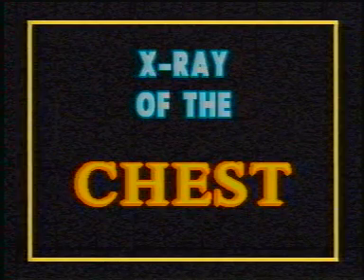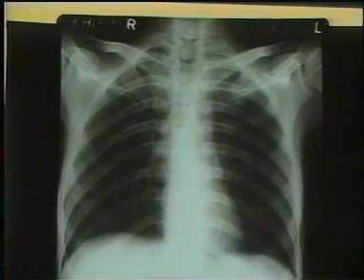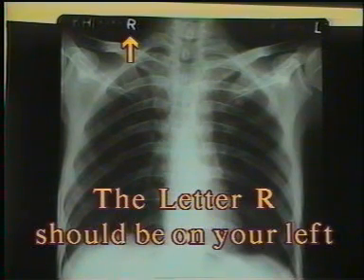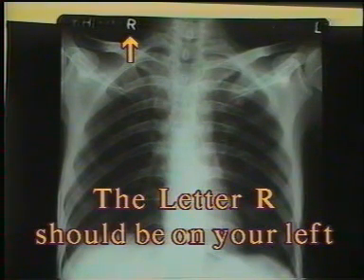X-ray of the chest. The first step in reading an x-ray film is to hold it correctly, upright and with the letter R on your left side, as if the patient is standing facing you.